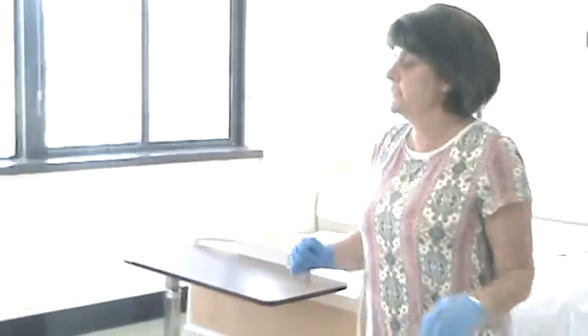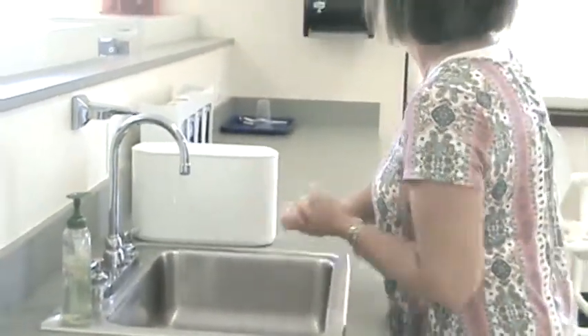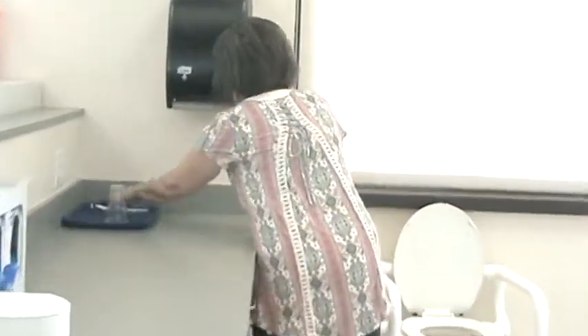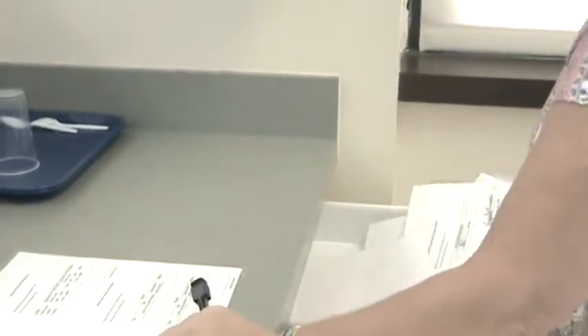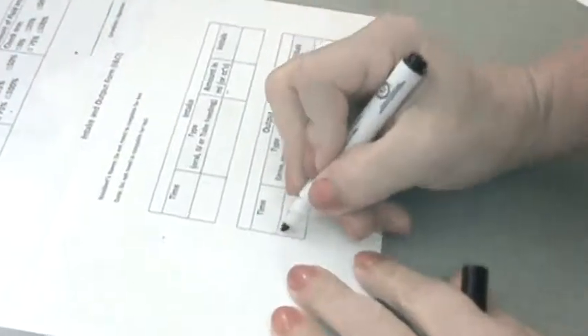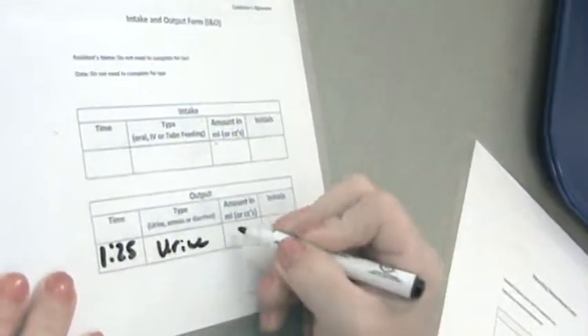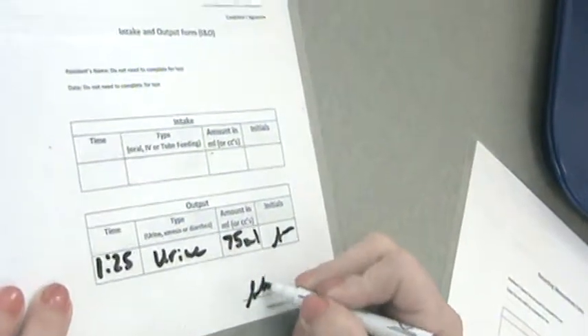Come back over to the sink and make sure I take my gloves off in the proper way. I threw them away, then I would wash my hands for at least 20 seconds, and then I will record my intake and output. The time is 1:25 — I emptied urine, I had 75 milliliters, and I put my initials and signed my name.